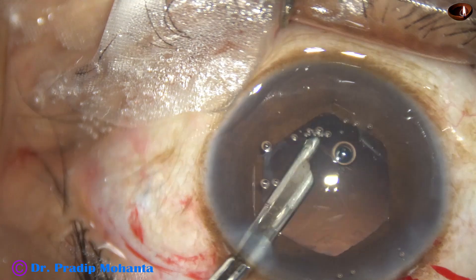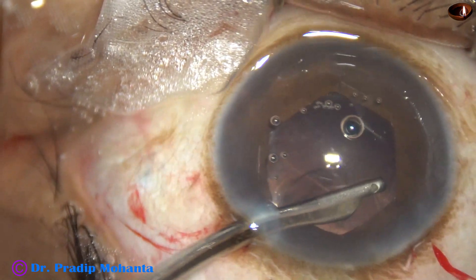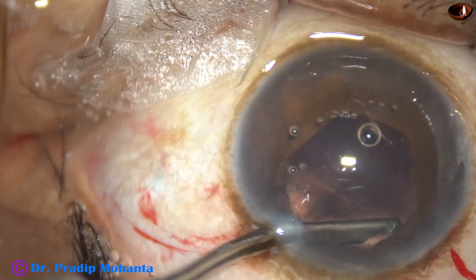In this case, we have selected a hydrophobic, acrylic, single-piece, monofocal, aspheric intraocular lens — a very good lens.